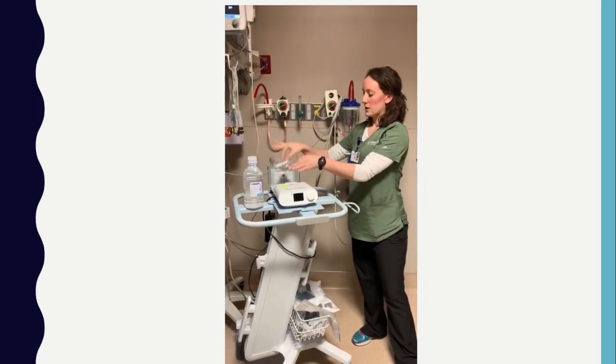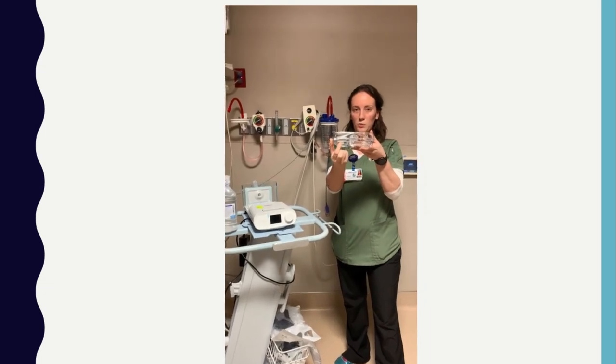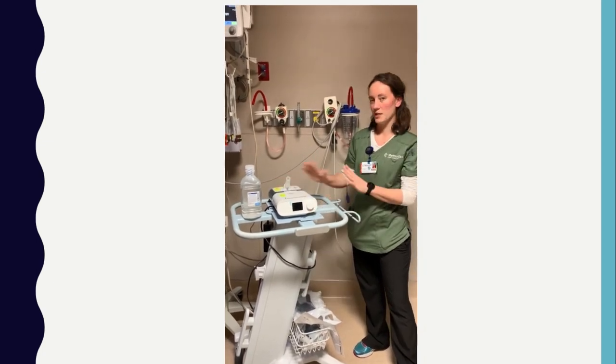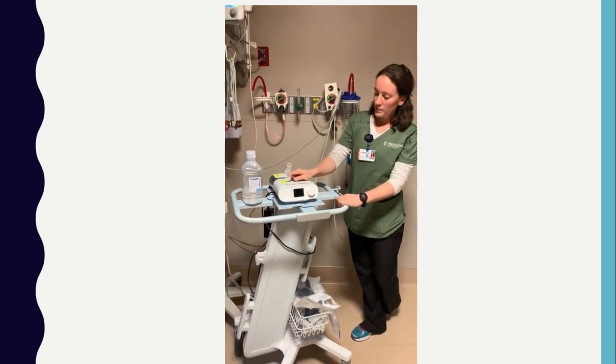You slide this back and you can actually take the tank out. It has a little max fill line right there so you know exactly where to put the water. You place it back in the machine. And then whenever you close it, it seals it, so that way you don't have any type of spills or anything like that happening.